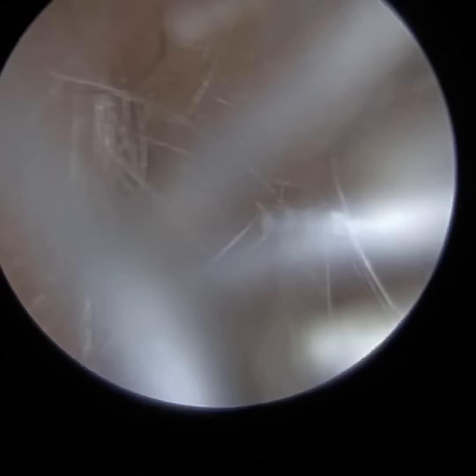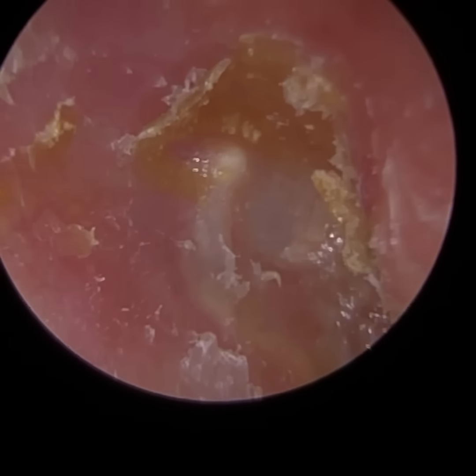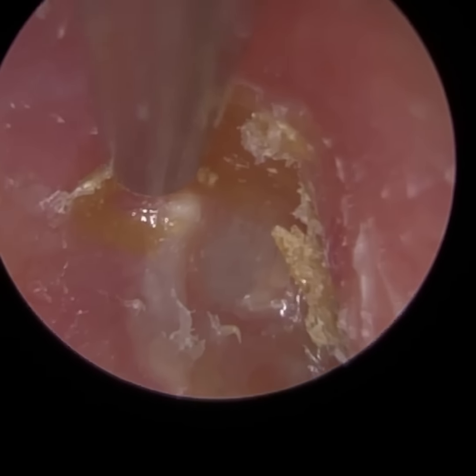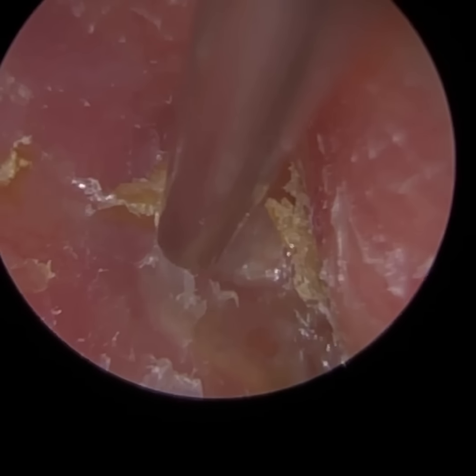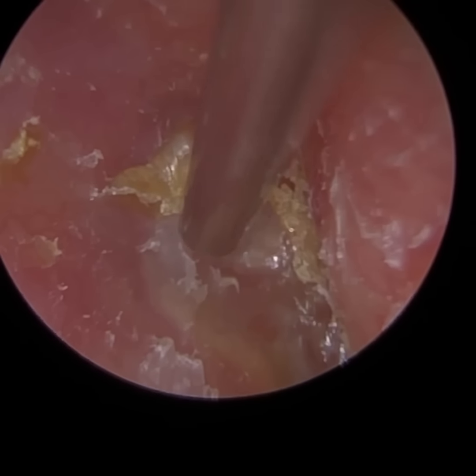The ear canal bulges inwards, and it's almost distorted the shape of the eardrum. Think about an eardrum being like an oval, but in here, the top part of the eardrum looks okay, so that's where I am now. But the lower half of the eardrum, it's really narrowed. It's almost like a V shape there. And the bone from the back is protruding outwards.